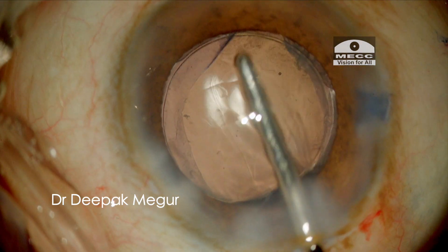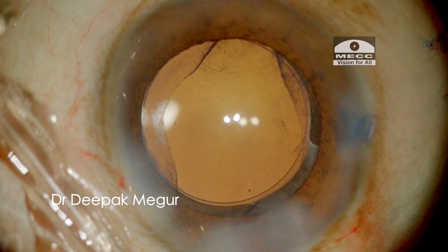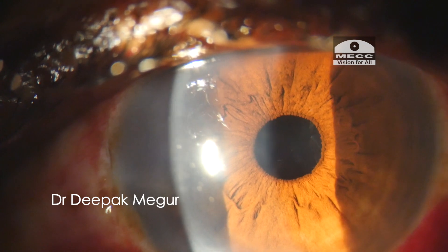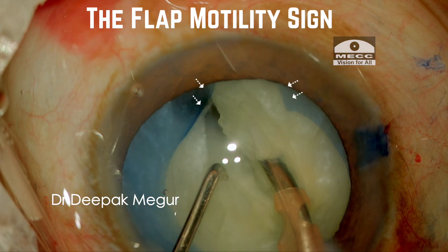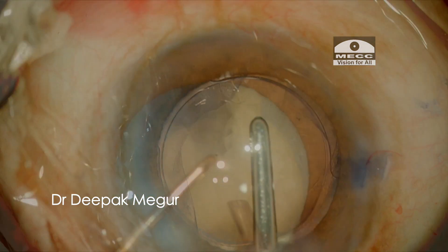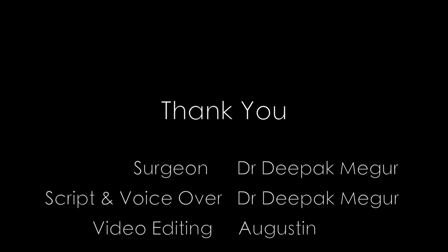At this stage you can still see the flap fluttering here, so all is well as long as the case does well. To conclude: watch out for the flap motility sign when you are in a situation where the rhexis has run away. As long as the intact flap is everted and fluttering, we are fine. The moment it stops fluttering or becomes inverted and stiff, be aware that the tear has reached beyond the equator and has possibly reached the posterior capsule. That's it for today, and thank you for your attention.